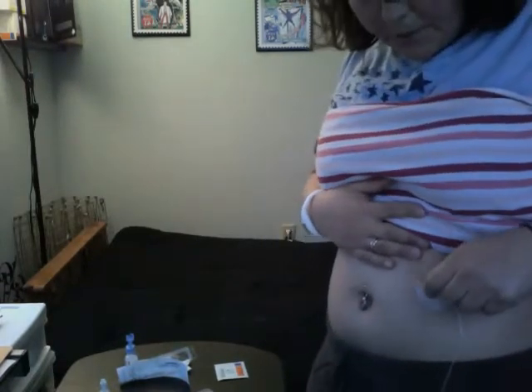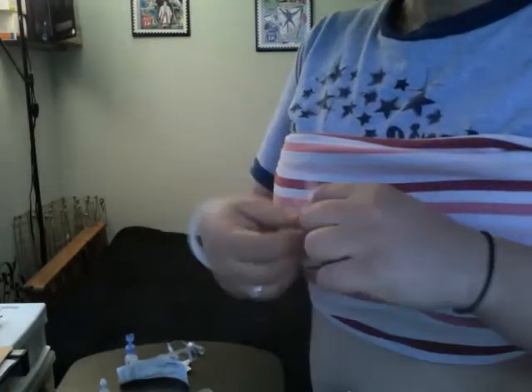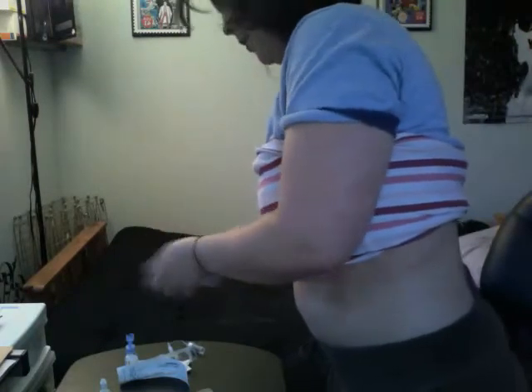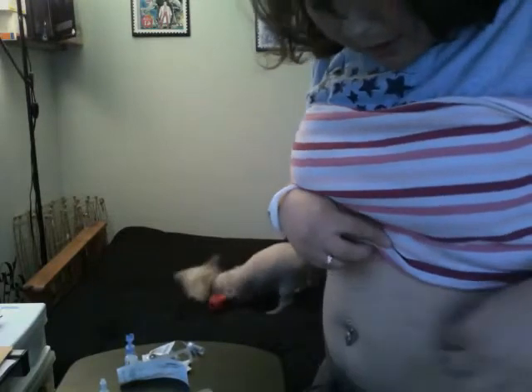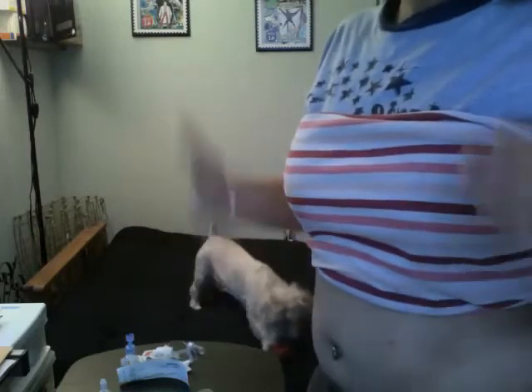And I'm going to pull that out. And I left a little mark. I'm going to use my IV prep pad, which makes the area a little sticky, and it also has some alcohol in it, so it cleans it. But it really just makes the infusion set really stick. Gonna wipe my area, let it dry. You don't want to blow air on this by using your hand or your mouth, because you can then push bacteria onto that area. So let it naturally dry by air.